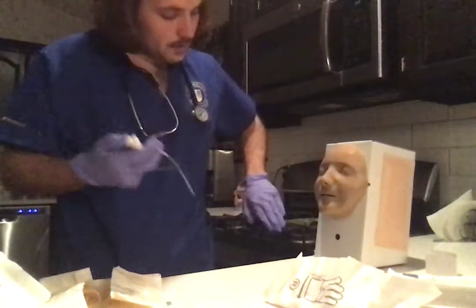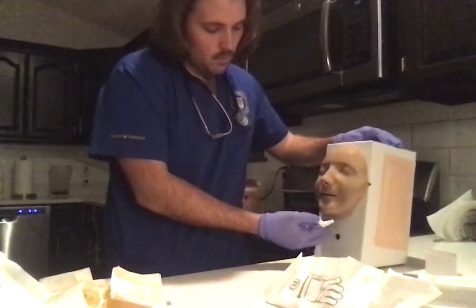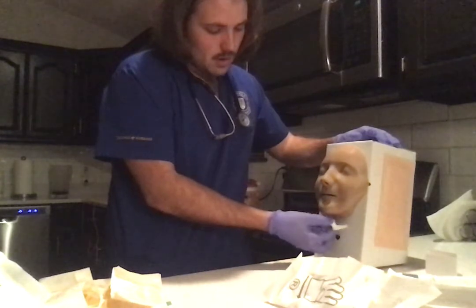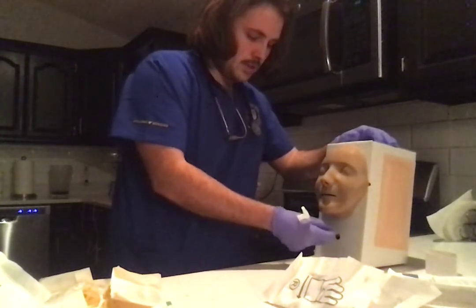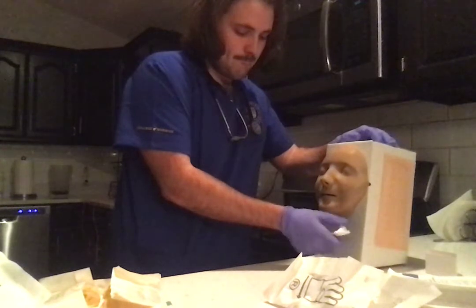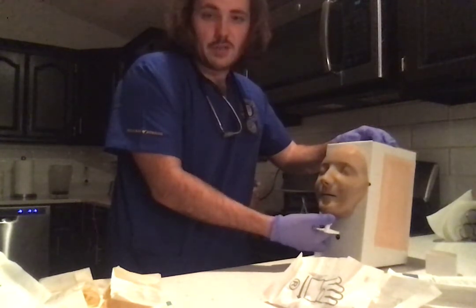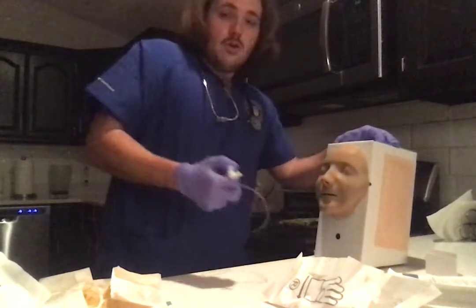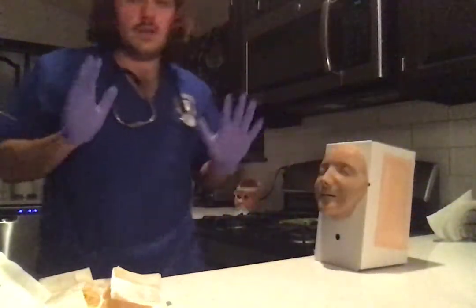Left hand, move trach mask. The dominant hand, insert, and slowly progress the tube down. Keep inserting until you've hit resistance or a cough. And then you would plug and begin removal. Again, suctioning doesn't want to last longer than 10 to 15 seconds. Once that's done, you would disconnect your suctioning, throw away everything you don't need. Keep your gloves on, because we'll be moving forward to the dressing change.